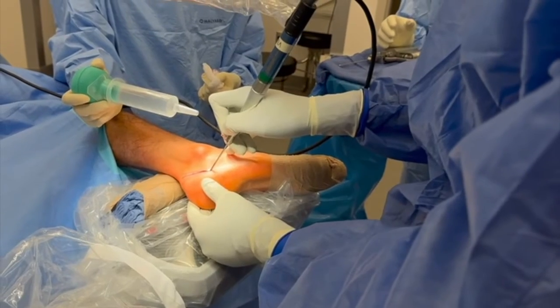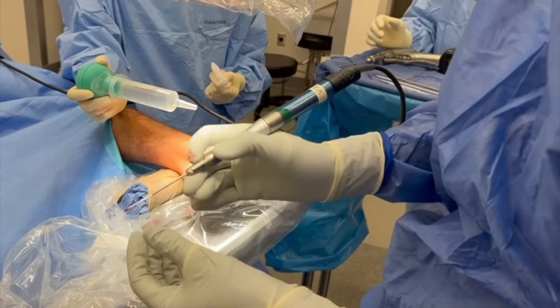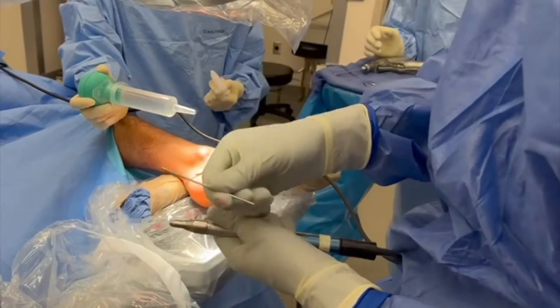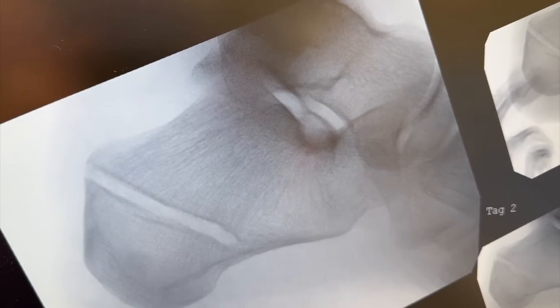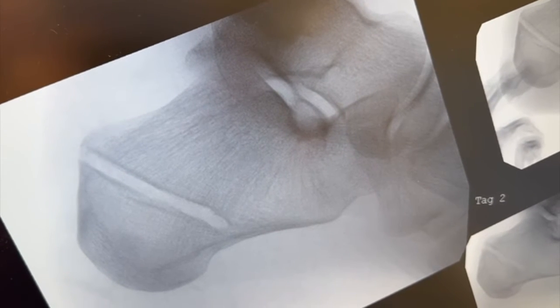I'm now going to do the first limb of the osteotomy. I'm using a 3 by 30 millimeter Shannon burr. This is a 10 centimeter burr as opposed to the typical 7 centimeter burr — you can see it's much longer. We've now completed the first limb of our calcaneal Zadek osteotomy.